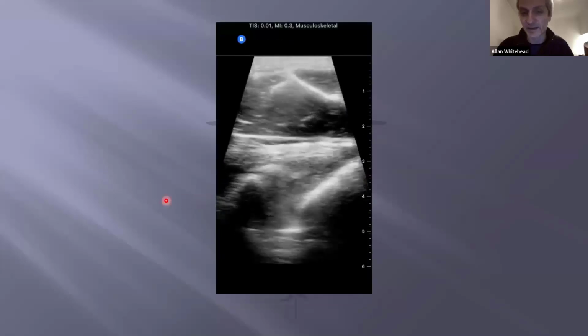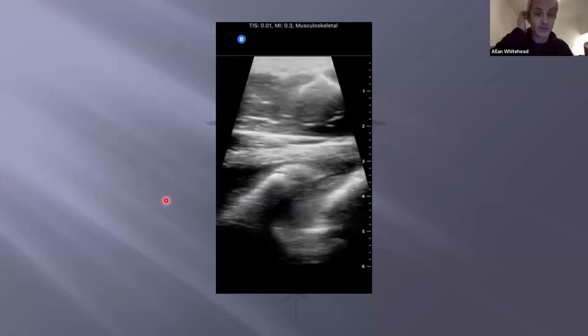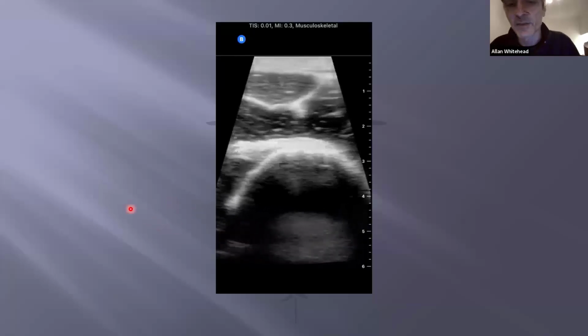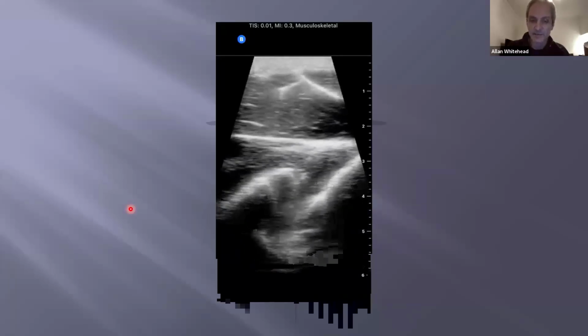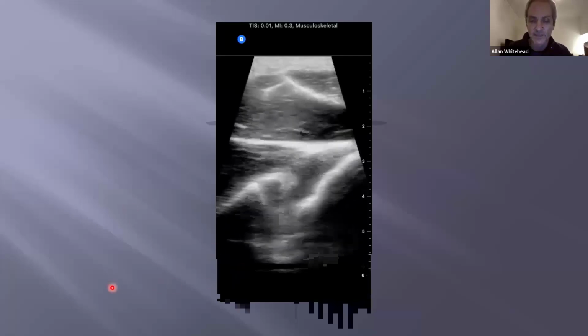And I thought, even better, why don't I demonstrate what happens with active motion, just so you get a feel. It looks really nifty. The clip plays for a little bit, but let's have a watch. It's really nifty to watch the humeral head articulating in the glenoid fossa, and even watching the tendons and muscles move at the same time. So we'll wait till that gets to the end of the clip.